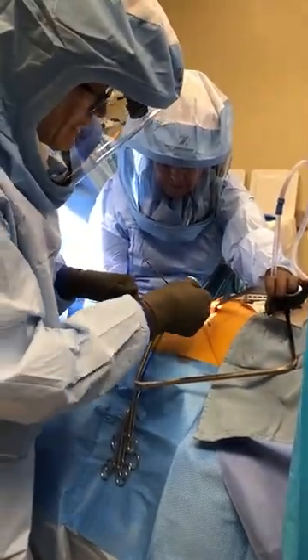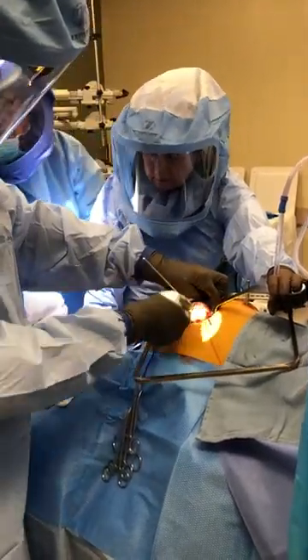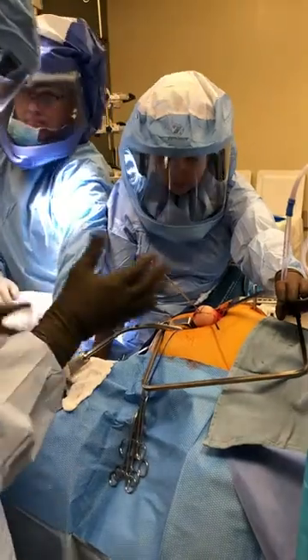And I'm clearing there — just contacting the neck. It's contact with the 44, but I'm going to cut a 52, so I'm way out of the way.